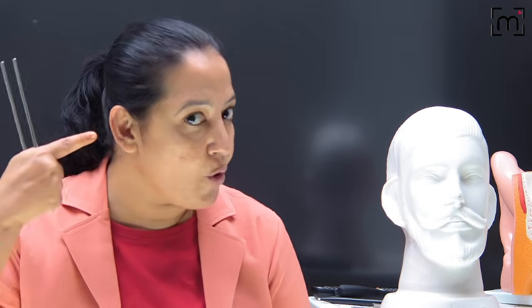But in normal and in sensory neural deafness, it is better when the canal is closed and it is softer when the canal is open. Obviously, common sense, because of the background noise. But when there is conductive deafness, there is already wax in the ear. Opening and closing of the canal doesn't matter because it is already having the wax.